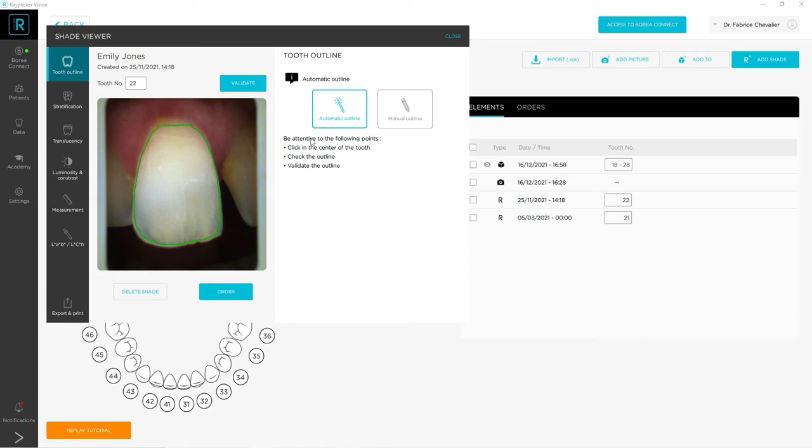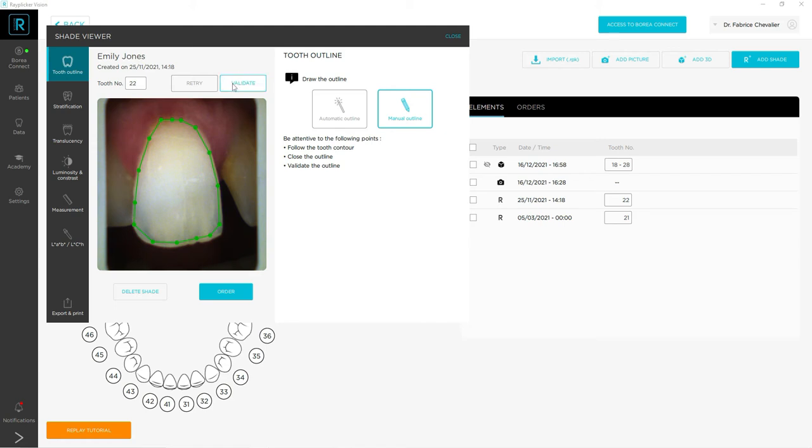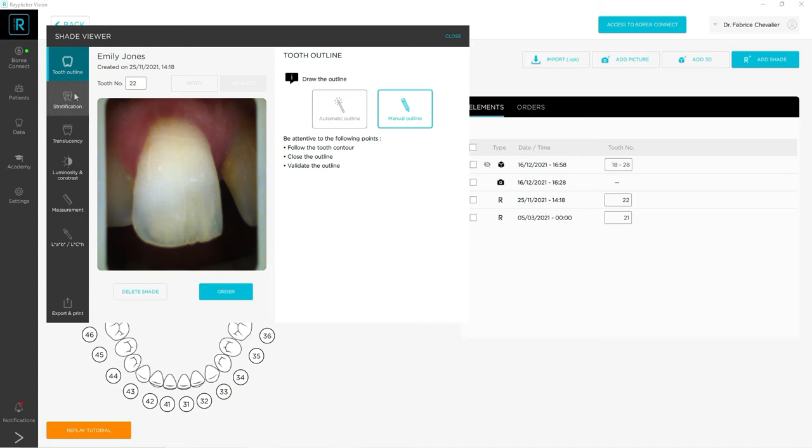But if you're not satisfied with it, you can do it manually. With this mode, you have to make point by point a new contour and you have to be very close to the edges and finish with the first point. Once you have done that, it will turn green and you have to validate if you're satisfied or you can retry.